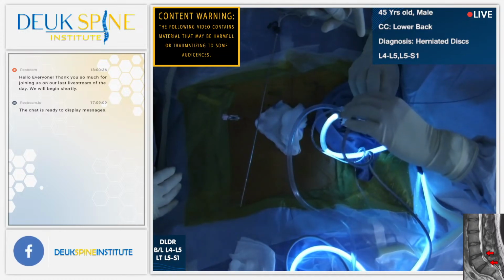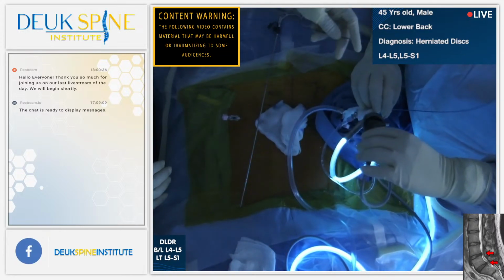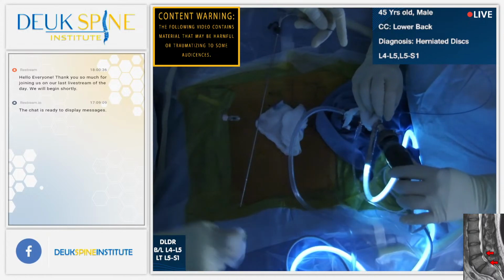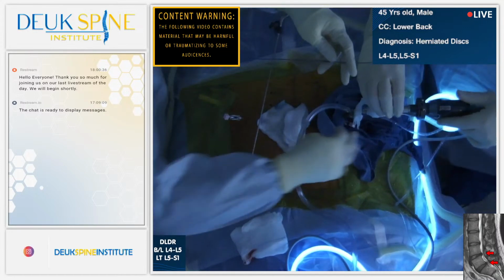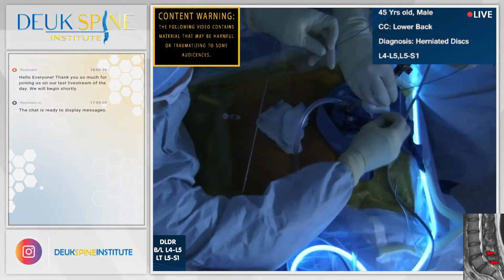I broke the fiber once, right when I was hitting it, pedal was on. This was probably 16 years ago when I started doing these. Can you pull it back just a little bit? It's kind of pushing my fiber where I don't want it.